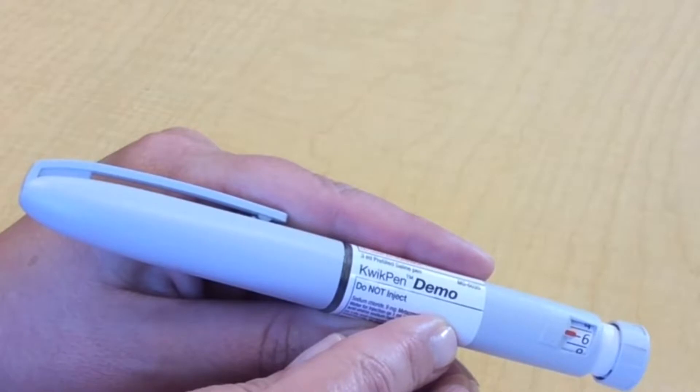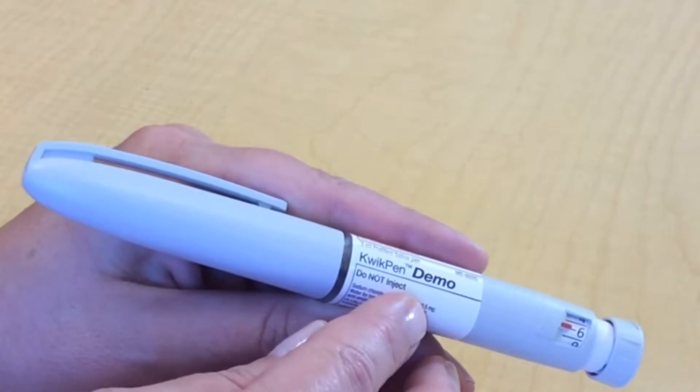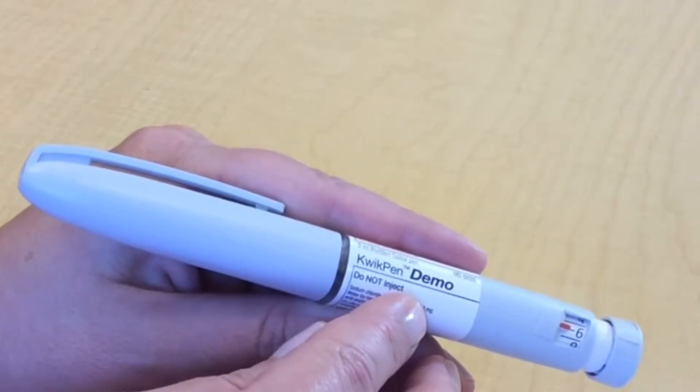Before you attach the needle, it's important to inspect your insulin to make sure it is safe to inject. Look at your insulin pen. Check the label to make sure that it's the type of insulin you should be using and that the insulin is not expired.